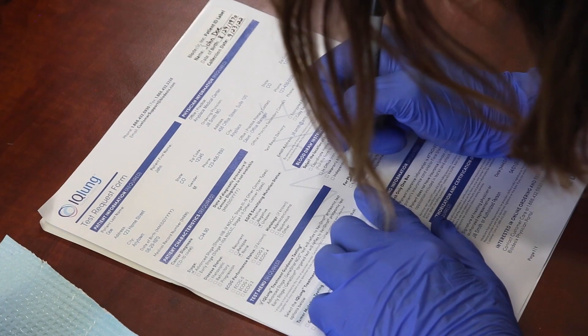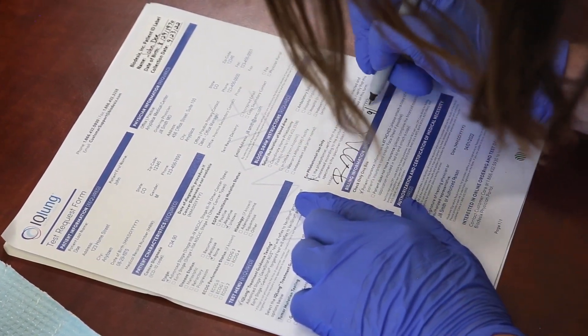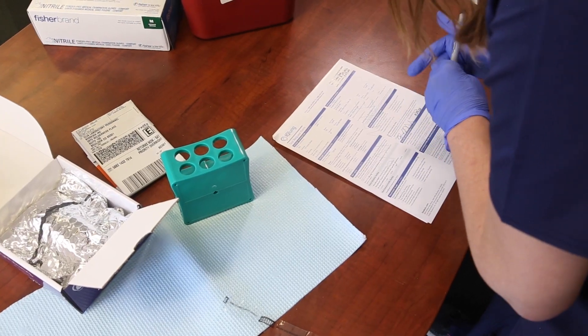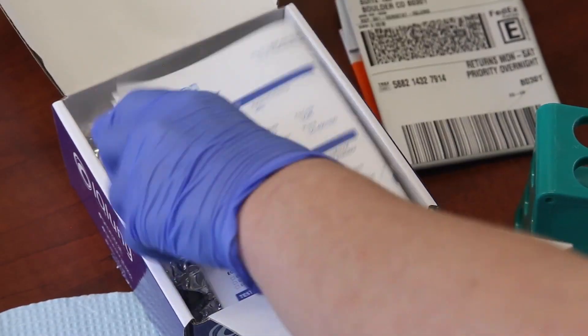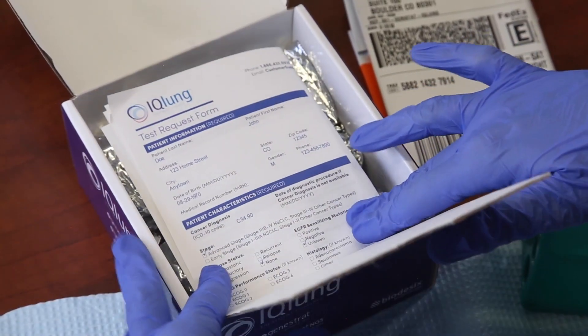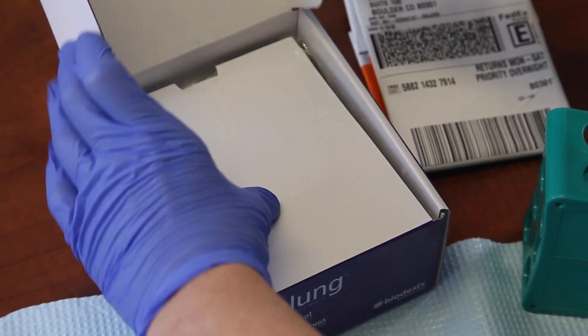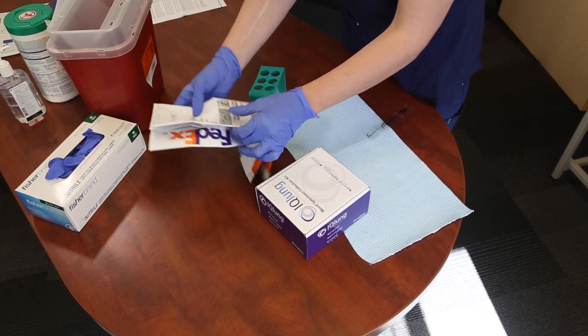Please ensure that the test request form is signed by the ordering physician and initialed by the phlebotomist who performed the blood draw. Also ensure that the completed patient ID label is on the form. Place the completed and signed test request form into the kit box. If the draw is completed in a physician office or hospital, please include a copy of the patient's insurance information.